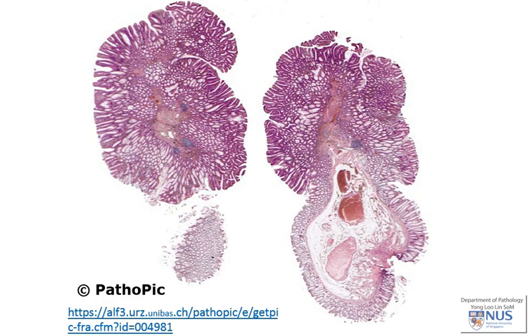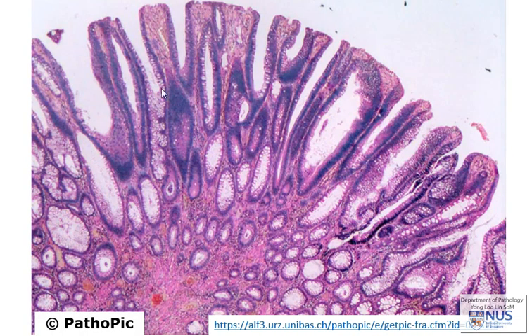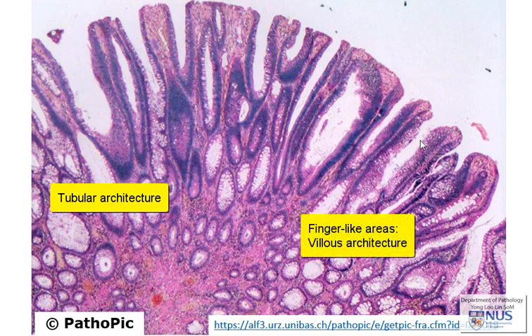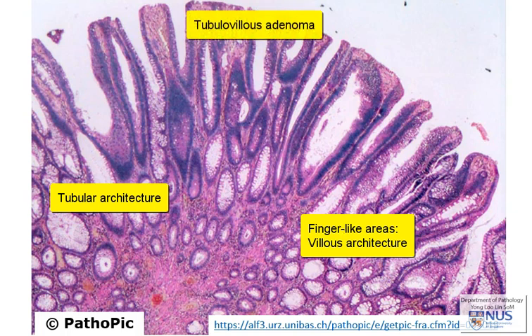At higher power view of the polyp, in some areas the architecture is fairly tubular - you can still see the crypts dipping down. If a polyp is comprised predominantly of these areas, we call it a tubular adenoma. However, if we have other areas that appear more finger-like, and that is the predominant appearance, we call it a villous adenoma. In this instance, we can see both mixed architecture, hence we call this a tubulovillous adenoma.